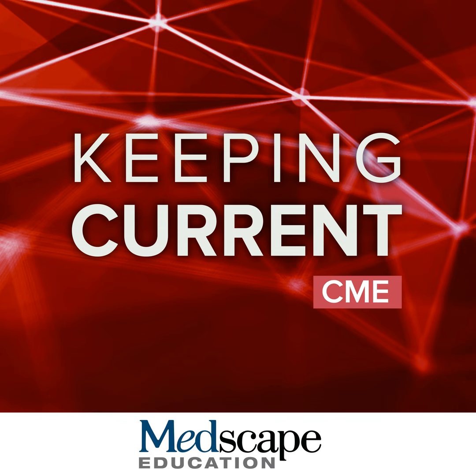Now, this is an example case that I think is really, really important to look at and talk about. So, this was a 75-year-old patient with cognitive decline, and this was his baseline amyloid PET scan. And what happened was his head position, you can see it's tilted at the time of his scan.